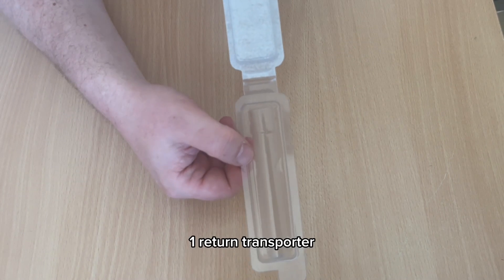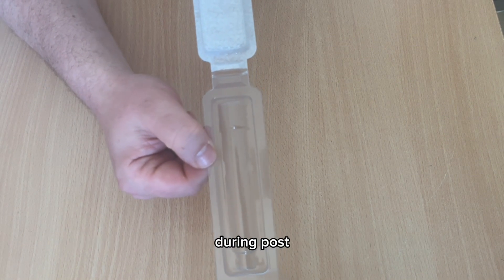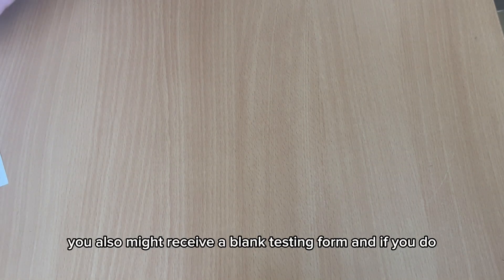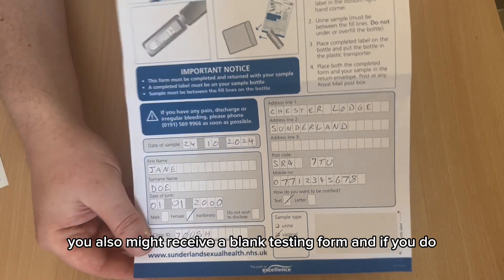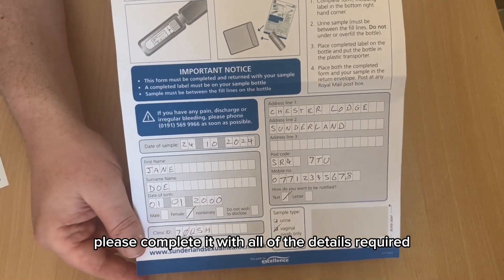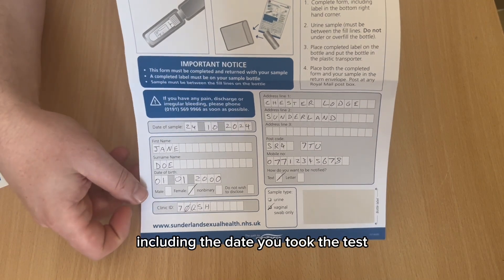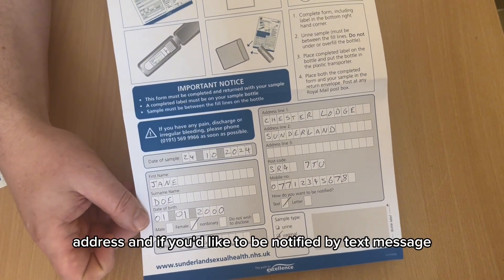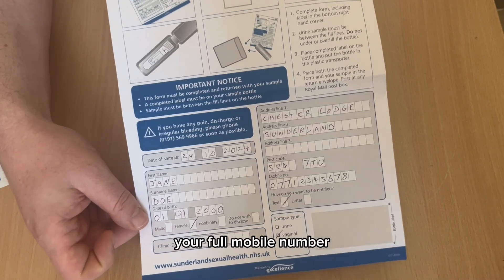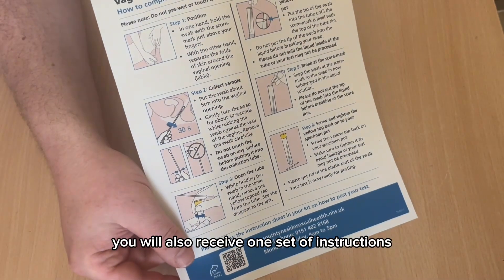It also contains one return transporter, which ensures there's no damage to your sample during post. You might also receive a blank testing form — if so, please complete it with all required details including the date you took the test, your name, date of birth, address, and if you'd like to be notified by text message, your full mobile number. You will also receive one set of instructions.